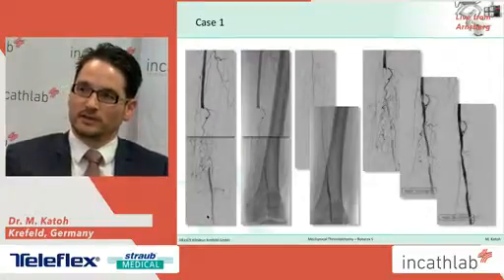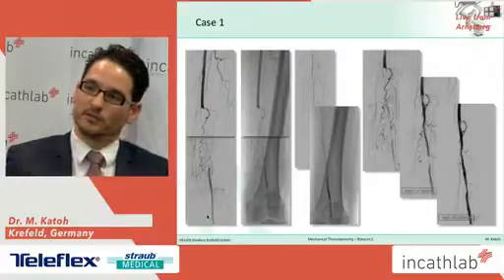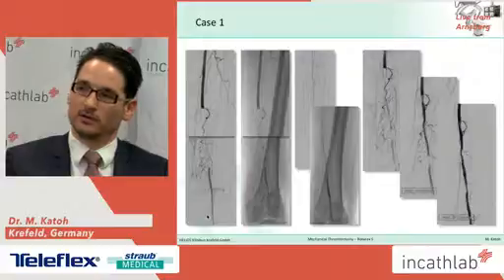So you can see that there is some residual stenosis, which however did not seem to be hemodynamically significant, since you can see the almost complete disappearance of the collateral vessels.